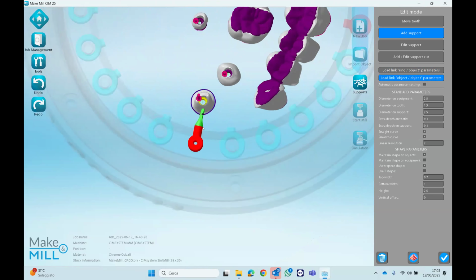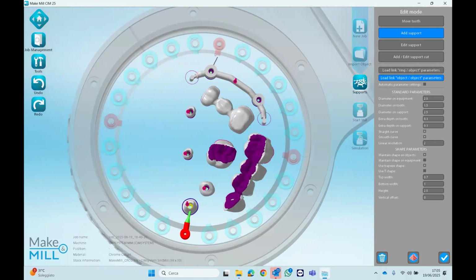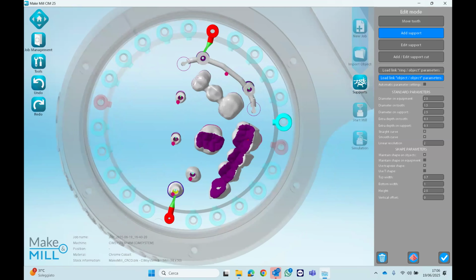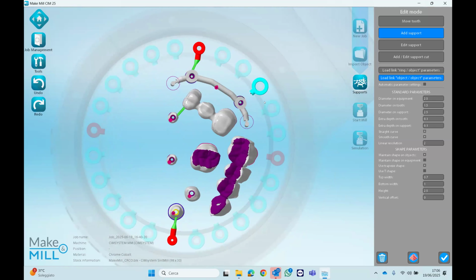So in this case here, we added this type of connection. You'll do the same thing on the other side, and you start like this with the process and just keep on going. Then you can just add one from here to here. I'm not going to do the whole job. I'm just going to show you real quick how it works because we don't have that much time.